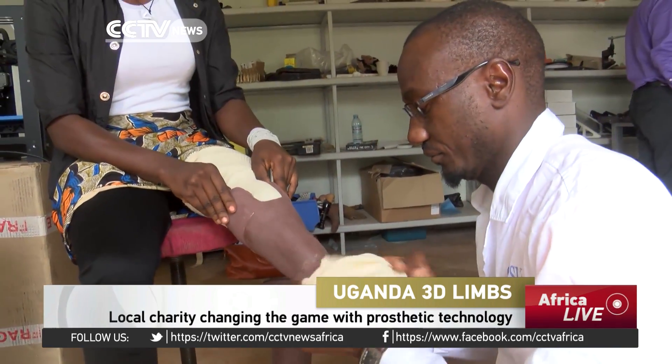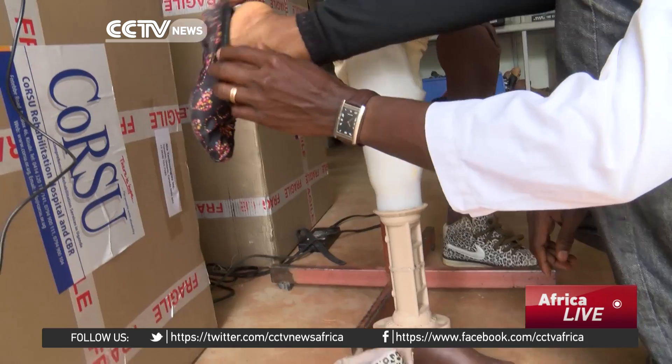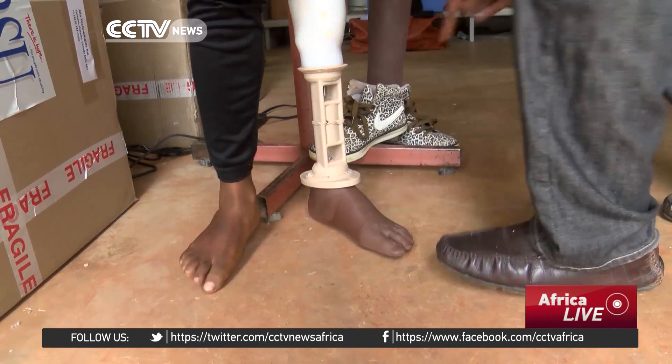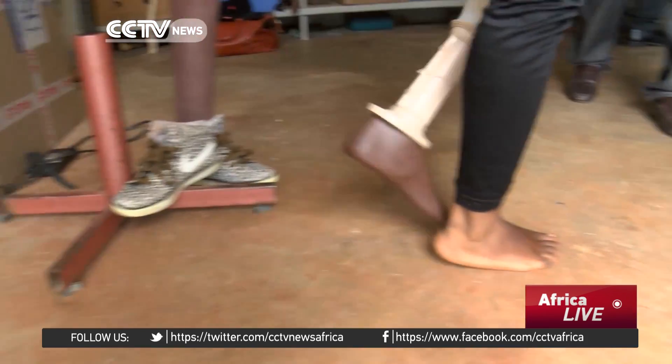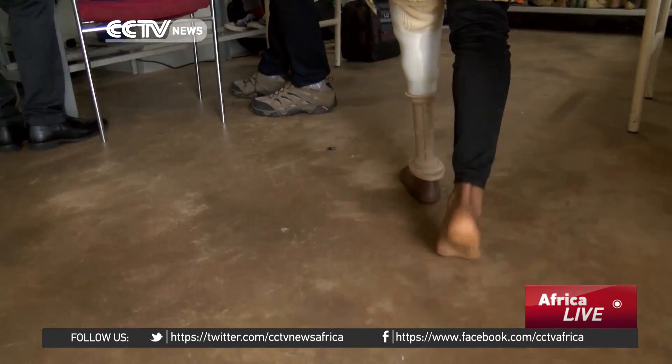Ruth Nakayo was born with one short leg. It was amputated and she had to acquire an artificial limb, molded out of plaster material. She says it was very uncomfortable until she replaced it with a digital version. The old fashioned limb is heavier than the 3D limb. She notes: 'I thought it would be maybe harder to use but it is easier. In fact I've learned to use it in a short time.'